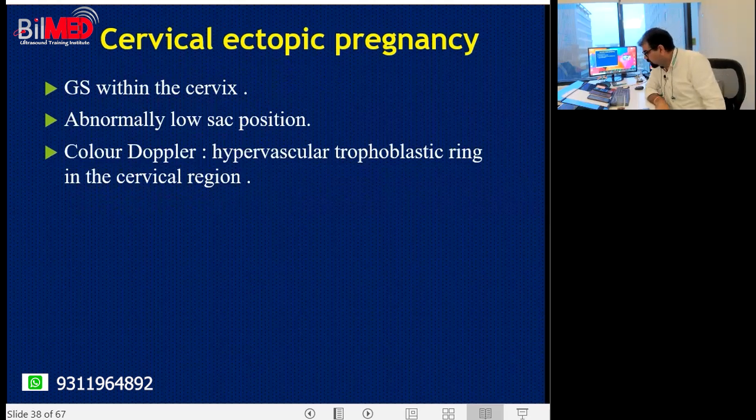Now, Doppler findings, you said. I don't have Doppler. I am a very poor doctor with an old machine. Don't straightaway jump onto the Doppler. These are just excuses, that Doppler. I don't have any magical stick in the Doppler. No.